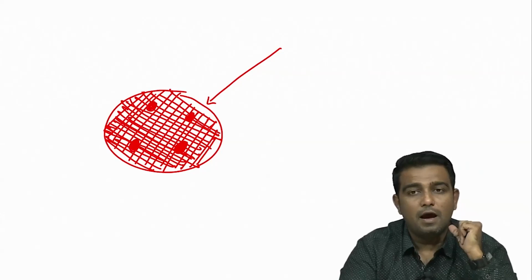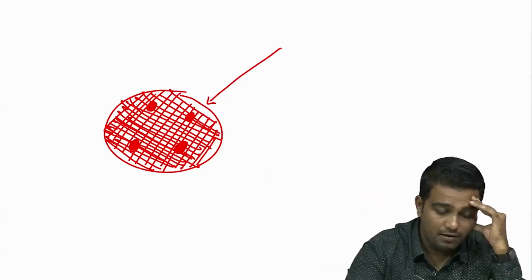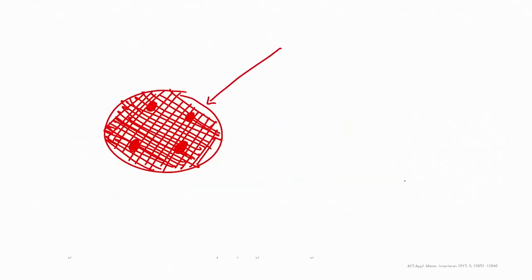Then, once the bacteria is grown, we load four different antibiotics. If there are 5, there can be 5 antibiotics, right. Now, if the antibiotic is effective, then what will happen? Then the diameter will increase. So, that is what we have seen here. You can see this particular diagram. What do you see? The diameter has been increased, right.